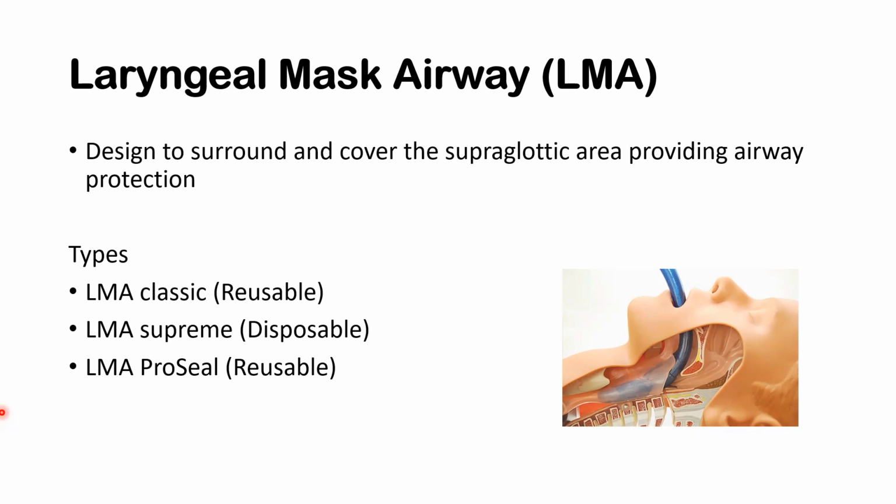So tengok dia punya tengkok macam mana. Dia dah patternkan airway dia. Okay, so airway dia okay, tak ada masalah. Problem bila patient tak sedar. So macam mana you kena preoxygenate patient tu. Okay, satu kena preoxygenate. Lepas tu tak ada masalah sebenarnya benda tu. Okay, so dia cara sahaja.